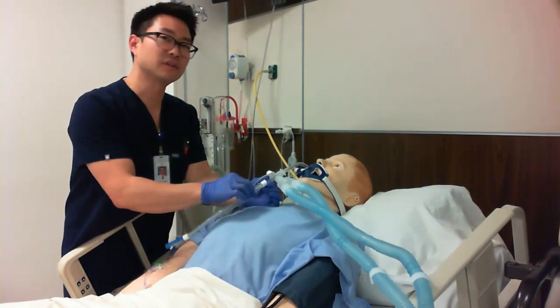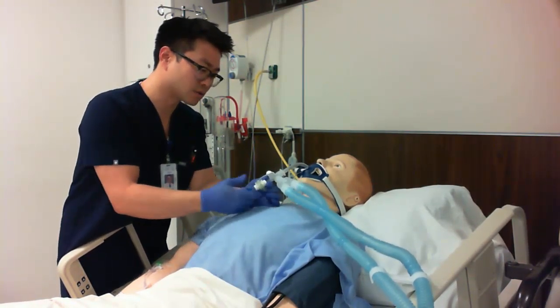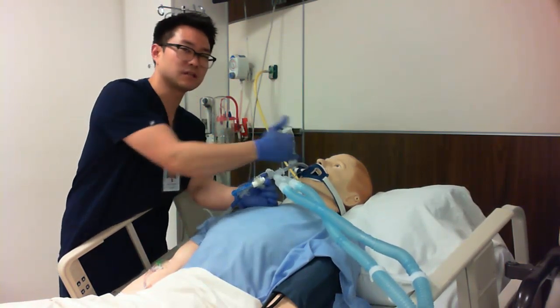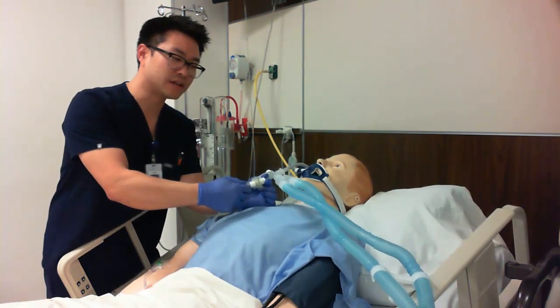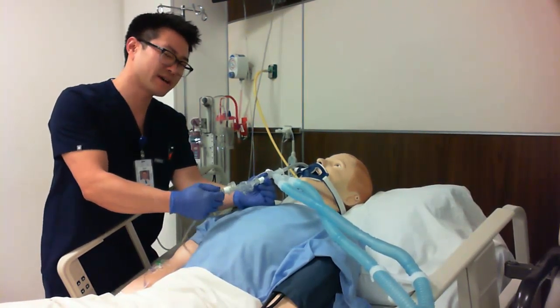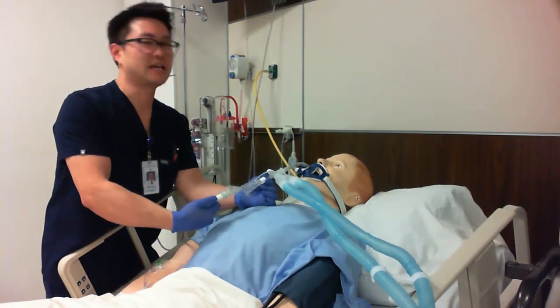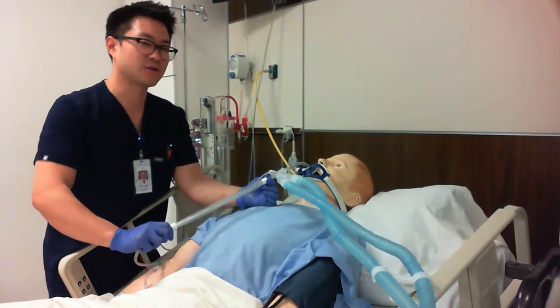You see it's very flimsy. We're going to start grabbing it there and start feeding it into the endotracheal tube, short strokes, real fast and quick. Nice and smooth and consistent, straight into the patient. Once I get in there, we do on and off intermittent suctioning, right? ATI, 10 to 15 seconds, ring a bell, and rotate. You can try and rotate, but you might notice that there isn't a whole lot of rotation going on.